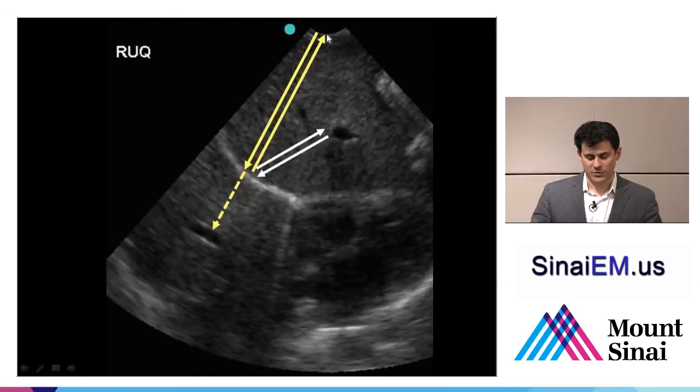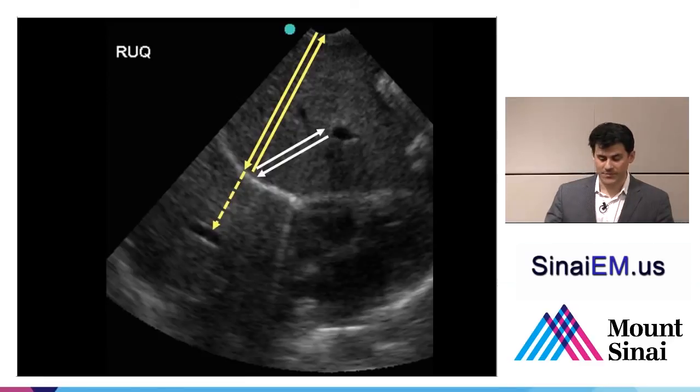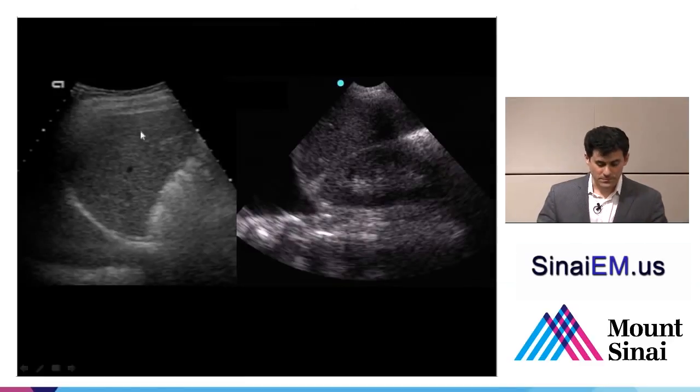So here again is in a real patient what this ultrasound artifact looks like. The ultrasound beam goes down to the diaphragm, reflects off to the side here, encounters a portal vein, bounces back off the diaphragm and heads back to the transducer. So the machine thinks all this structure here is this liver and thinks this structure here, which is the portal vein, is the structure that was actually up here. So this is how it looks in real life, and now why is it important?